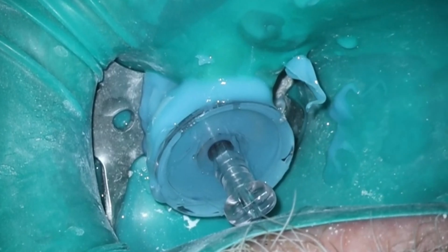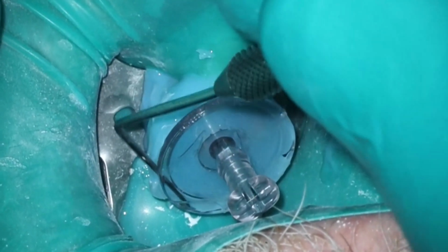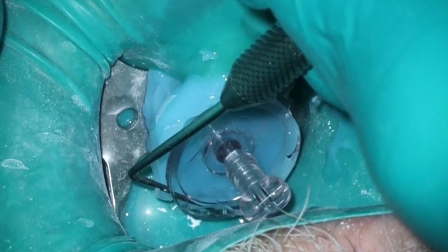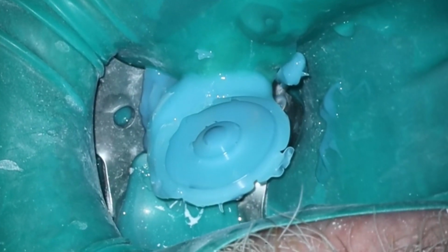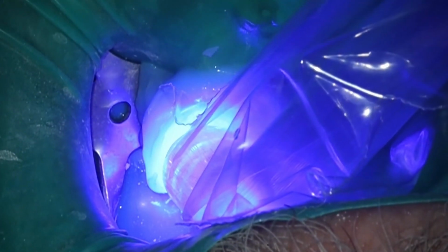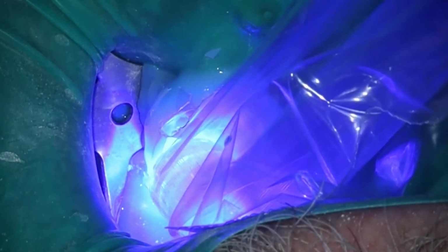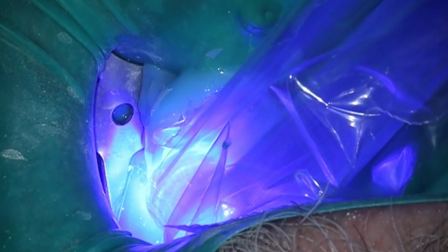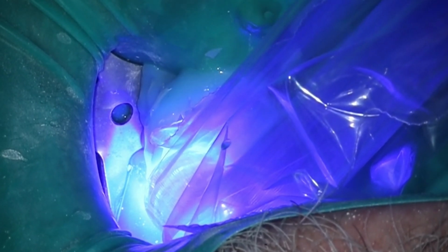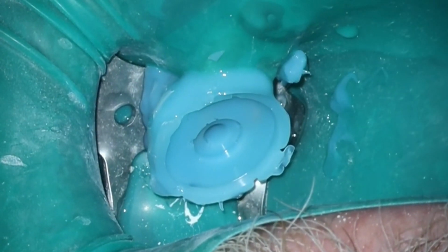I tend to, at this point, only use the GentleWave on really infected cases where I would be concerned about it still leaking. If I'm really concerned about bacteria, I'm going to do that in those cases. In this one, though, the case was still vital. This case isn't going to have any problems because it didn't need a root canal in the first place. So did I have to use it? No. However, I had already talked to him about it. We were already set up for it. It's not going to hurt anything. If anything, it's going to get it more clean. So may as well. We're going to go ahead and run the GentleWave here.